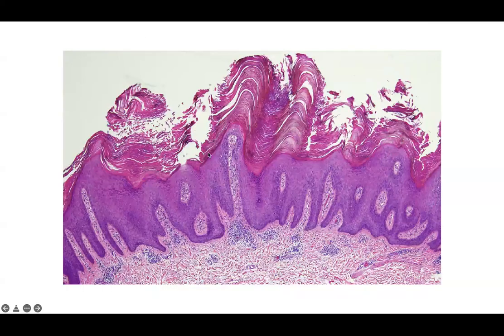Another example of that papillomatous nature with the alternating ortho and para, as well as hyper and hypogranulosis. It's also inflamed. So you may or may not see a lot of inflammation in ILVEN. That's not necessarily going to nail the diagnosis. It's more about the clinical with the linear distribution along Blaschko's lines.